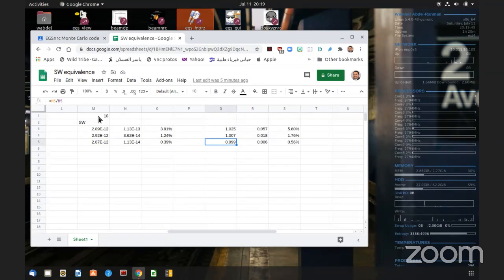Now, is this the same case when we use 6 MV? I really don't know. 10 MV, 15, I really don't know. We need to run the simulation with the same concept, with water surrounded by solid water. Yes, the attenuation is different. At 10 centimeters, I don't have an inverse square problem. The attenuation is a bit different, but somehow this might be compensated by scattering in solid water. And another thing, maybe this is field size dependent.